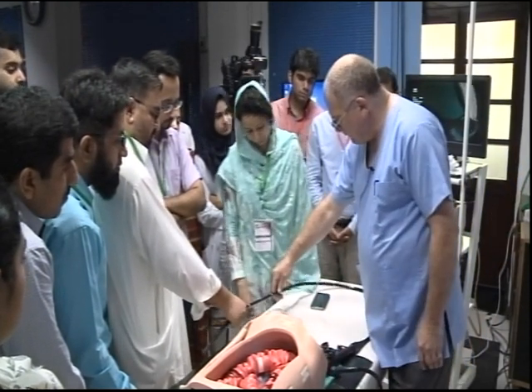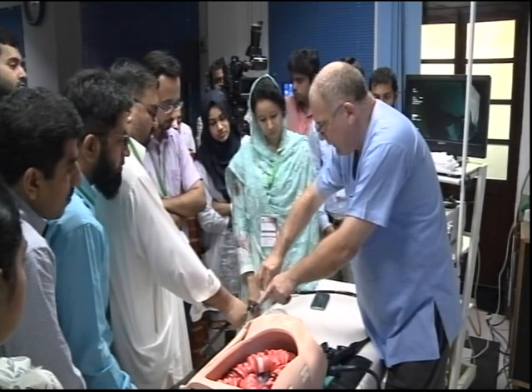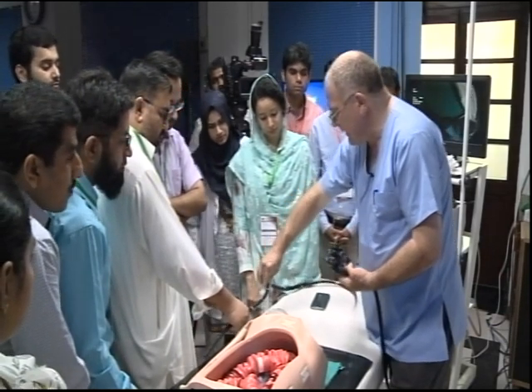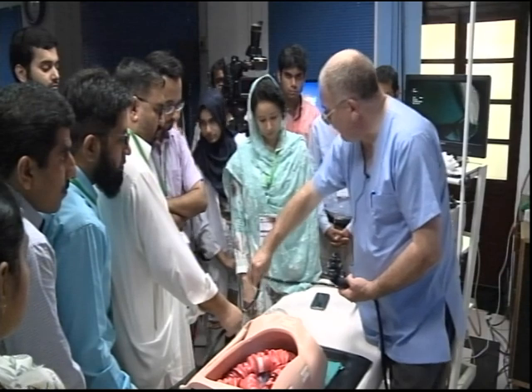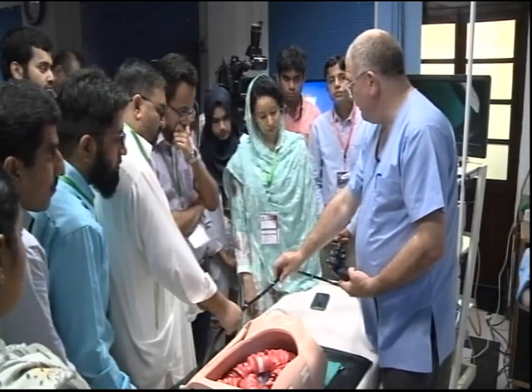Hold the scope and rotate it. If you break your wrist to come round, you're actually not increasing the torque. Watch what happens to the torque here. I'm going to go the way you did, there. Now, as I bring it round and straight, look at the 40. Look at the scope itself. As I take it off, the torque comes off. As I come in, the torque comes on. So you keep it in a straight line.